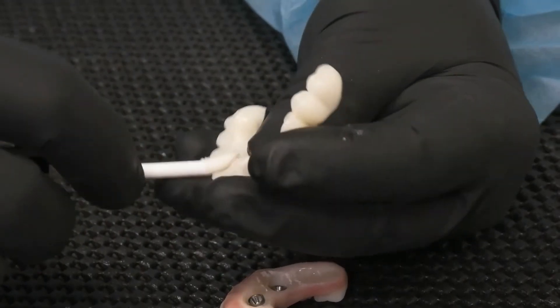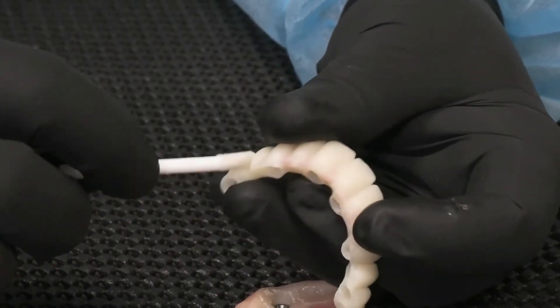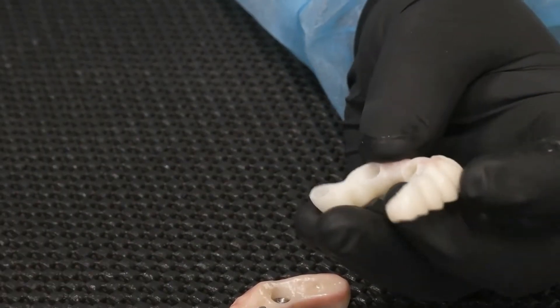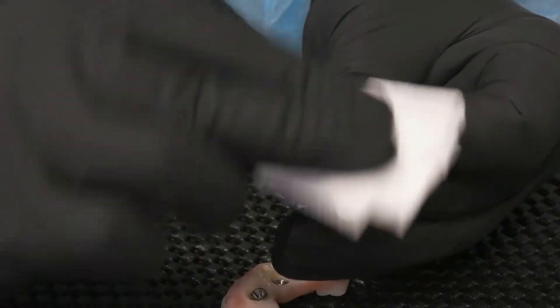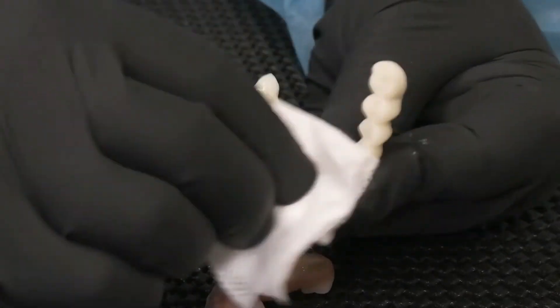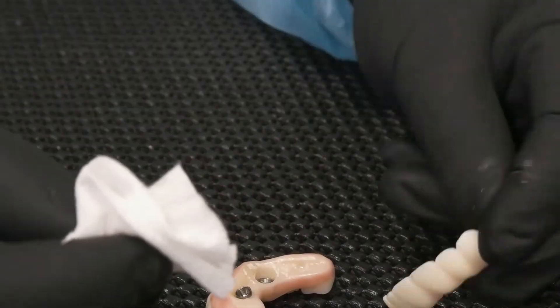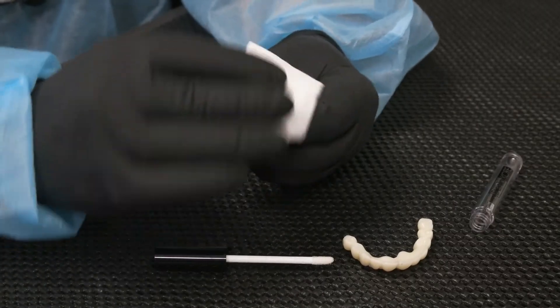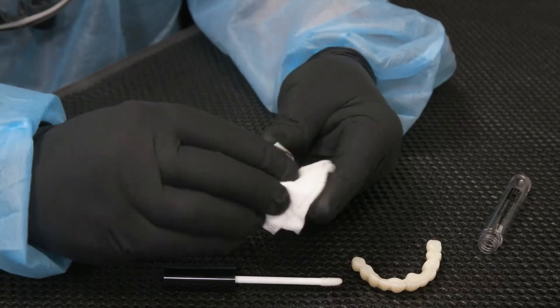When completed, the critical spot is to grab your 2x2 gauze and wipe it. Aggressively try to clean it as much as possible. Go back to the screw retain bridge that we did earlier and just wipe it down.